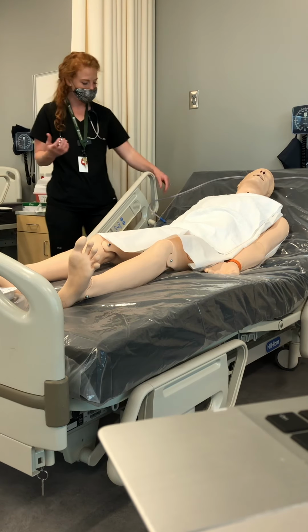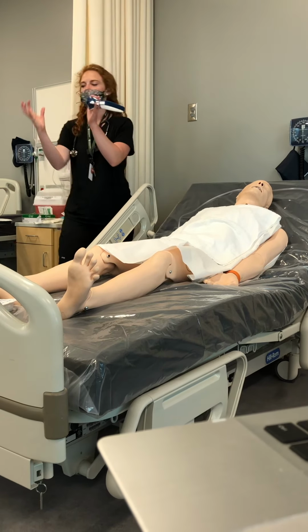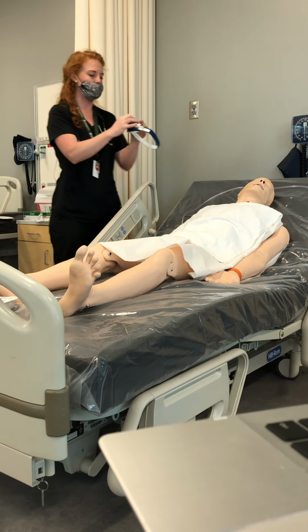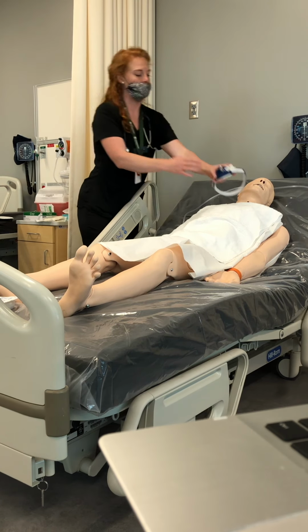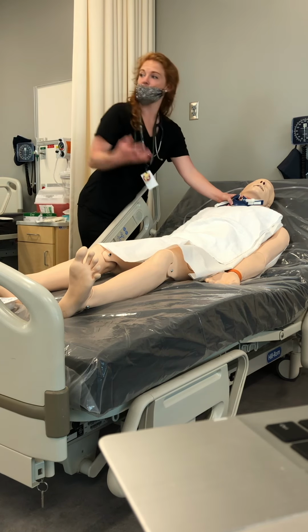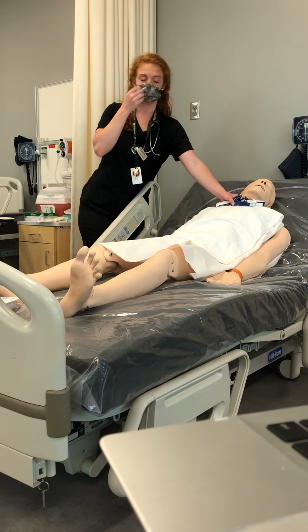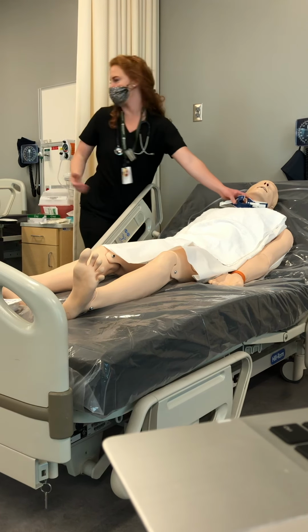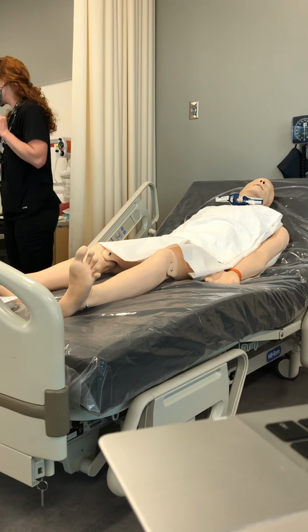Most of the time, if you have oxygen going over, typically the trach dome goes right over top of the opening of the tracheostomy. You can just leave it. When we take it off, we would just leave it right here so they're still getting a little bit of extra oxygen as you're doing the procedure. So you're not just totally taking it all the way off, but you leave it there for them. It'll just sit on your chest.